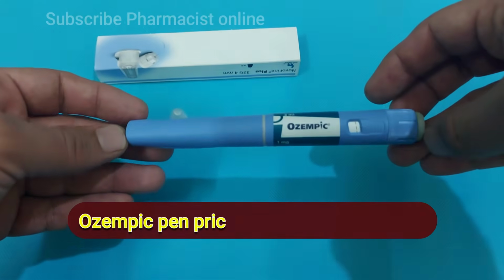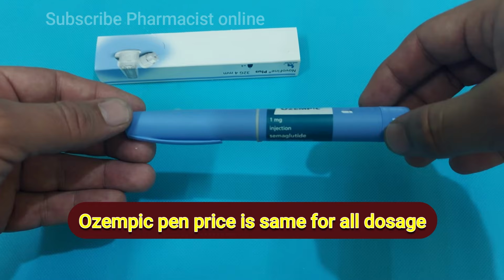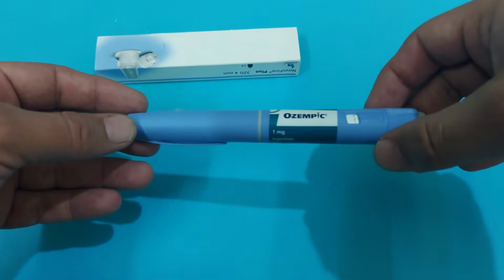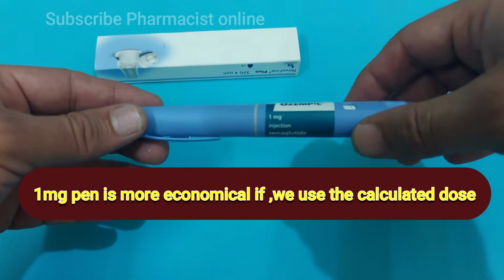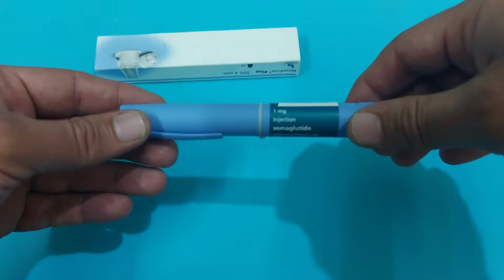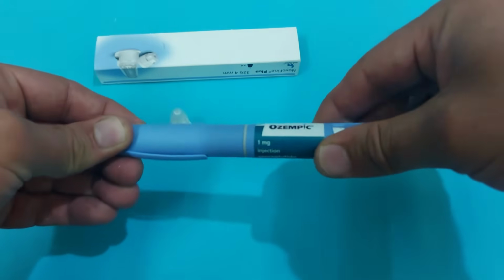The price of the Ozempic pen is the same for 0.25 milligram, 0.5 and 1 milligram. So it is better if you buy the 1 milligram, as this will be economical for you, and you can calculate the dosage and take your 0.25 milligram dose in the first month or 0.5 milligram in the second month. Let's see how you calculate this.